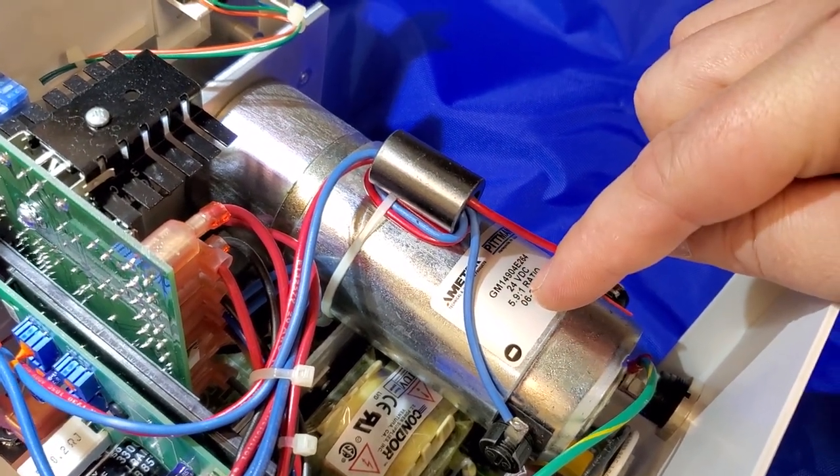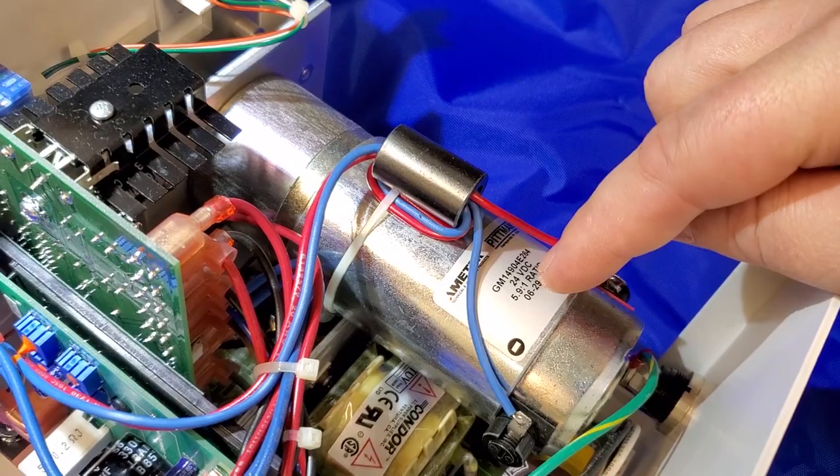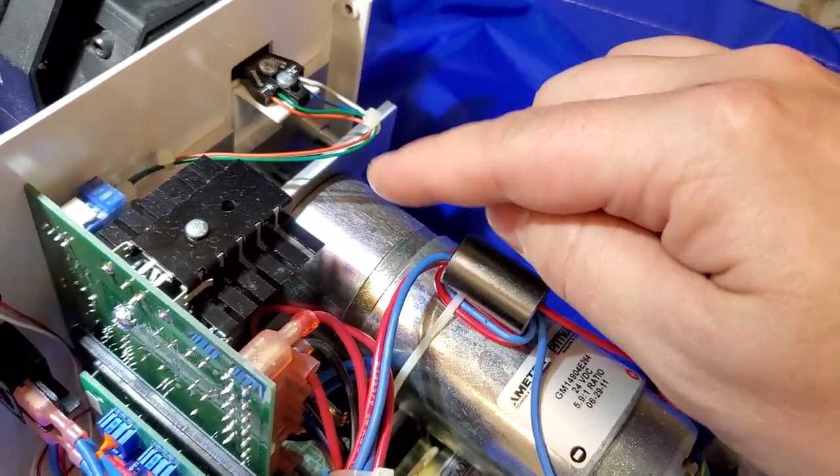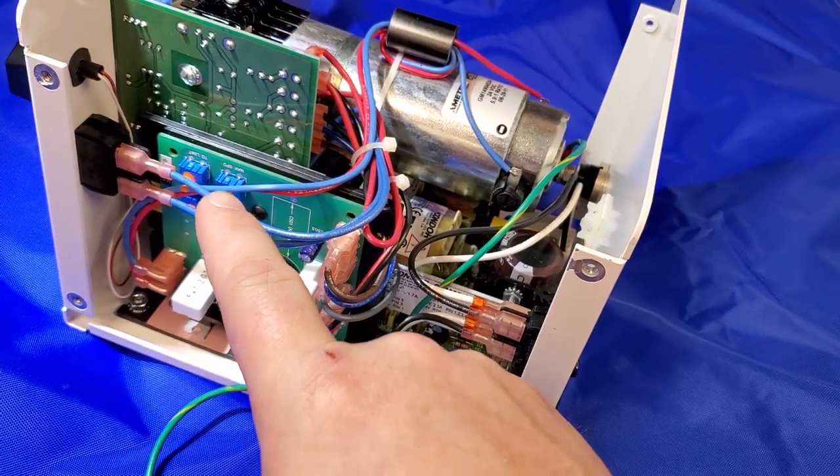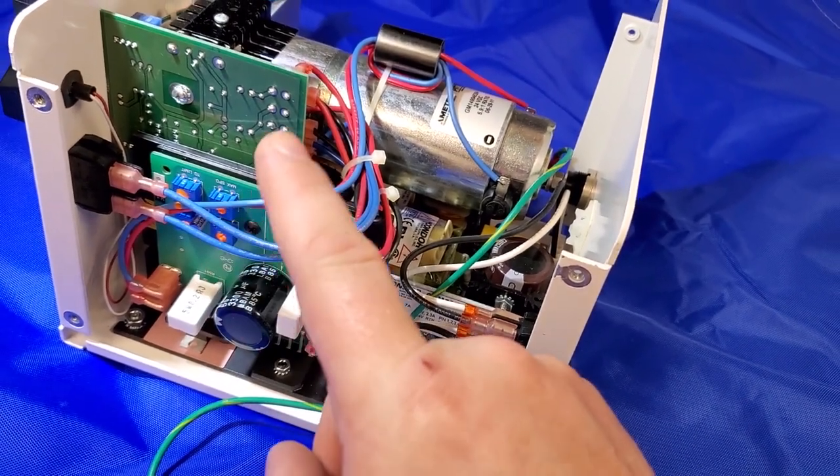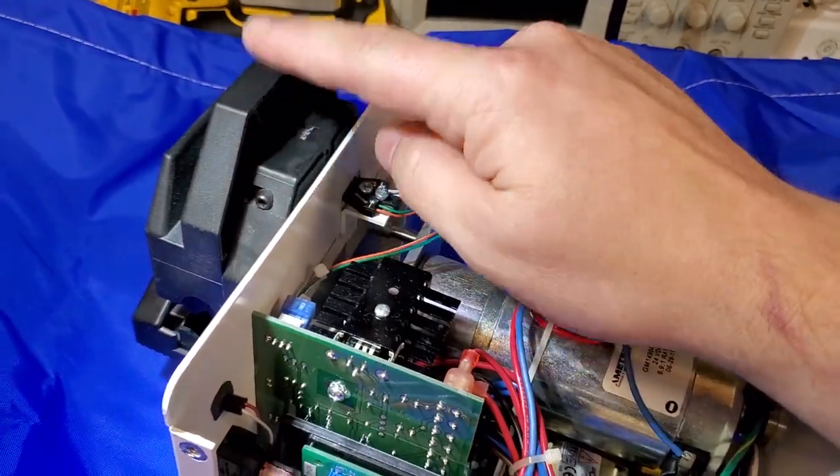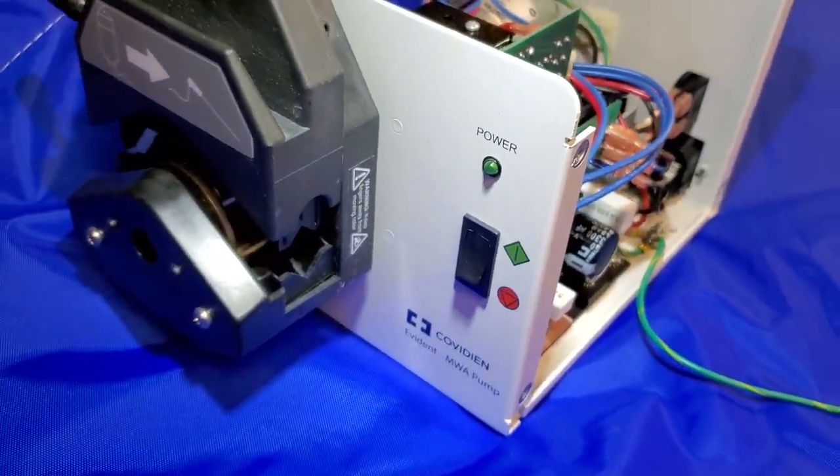You can see it right here. It's a 5.9 to 1 ratio. So that's already a pretty steep reduction, but they can also slow it even further by using pulse width modulation. And that's how they can control your calibration of your output on this peristaltic pump.